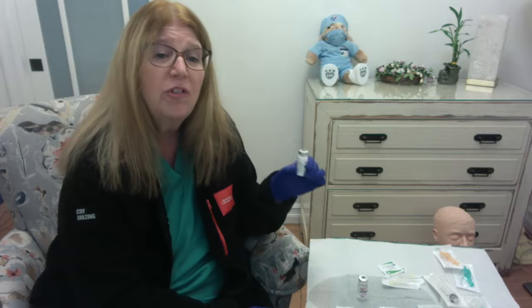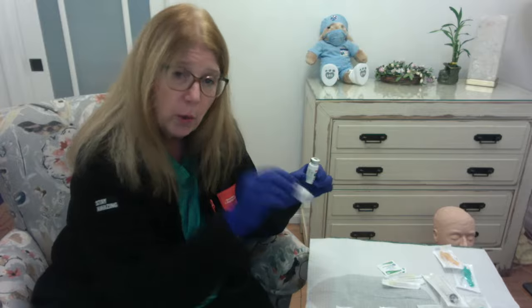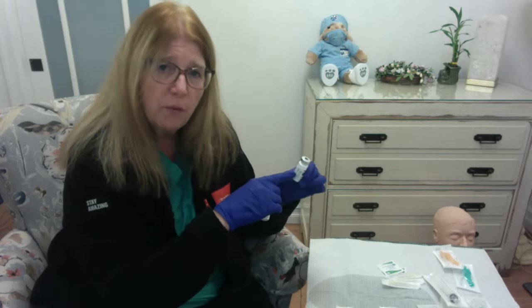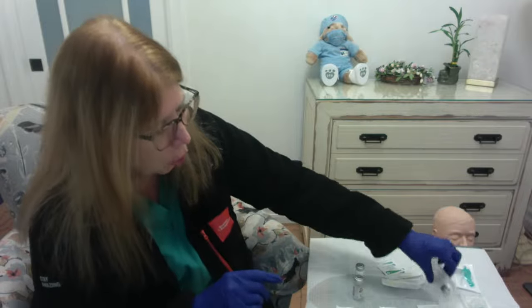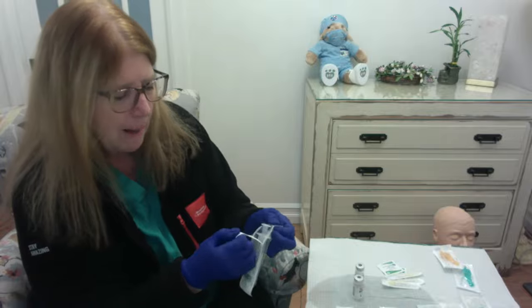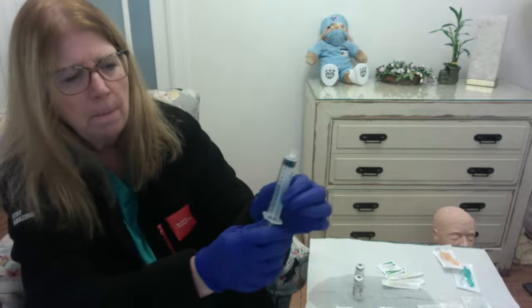And we said that we're going to make this into the concentration of 400 milligrams per milliliter. So I need to put 7.5 milliliters of diluent into this vial to get that concentration of 400 milligrams per milliliter. So I'm going to use a larger syringe now. I'm going to use the 10 milliliter syringe. Okay, so 10 milliliter.